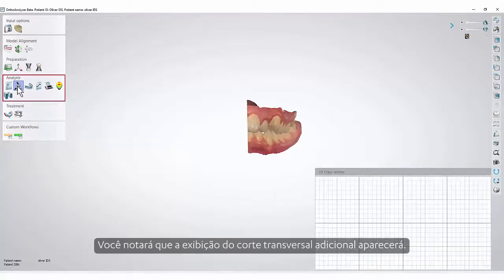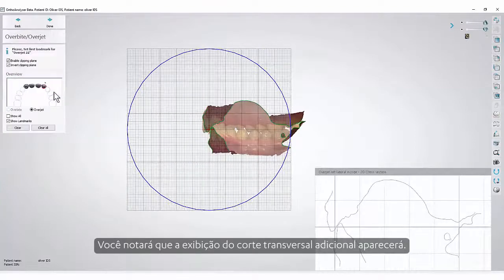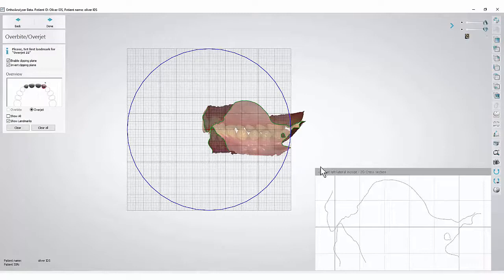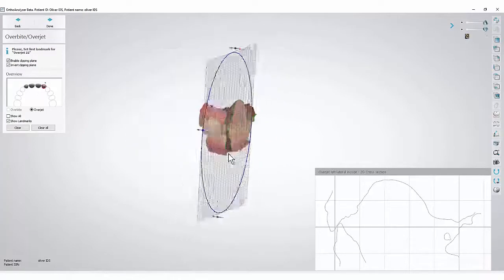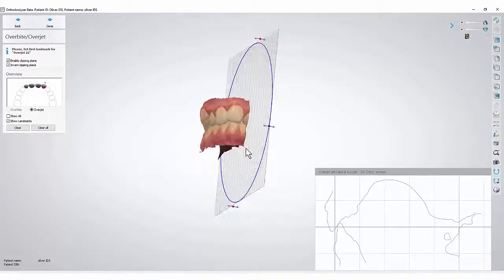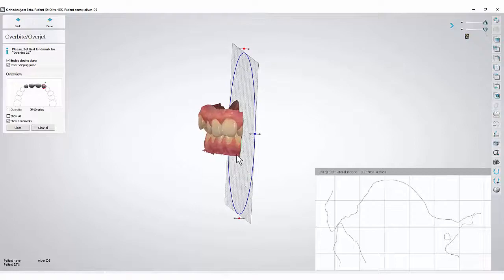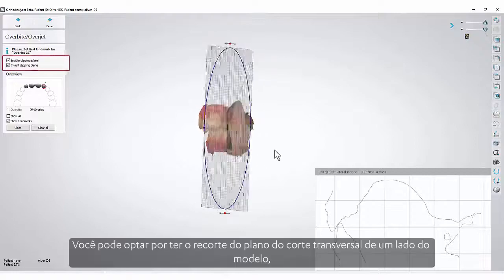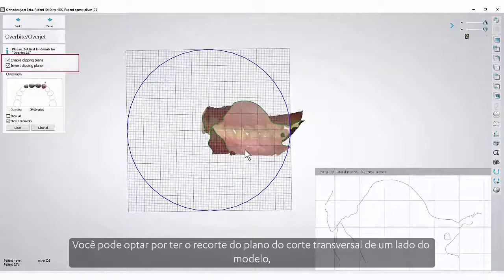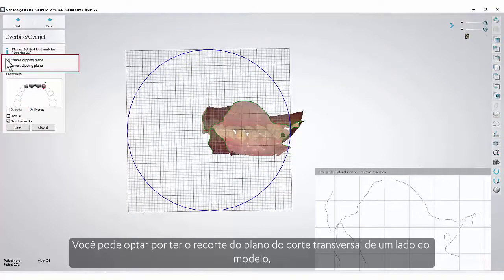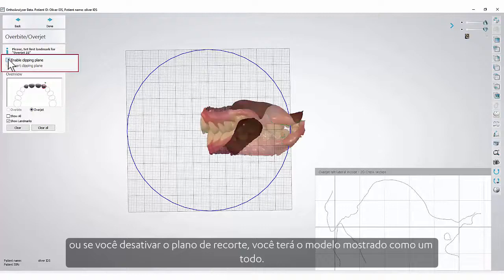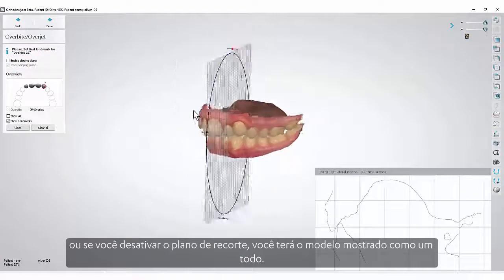You will notice that the additional cross-section view will appear. You can choose to have the cross-section plane clipping on one side of the model, or if you disable the clipping plane, you will have the model shown as a whole.